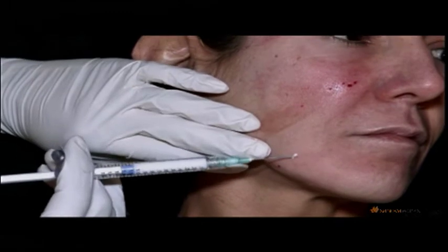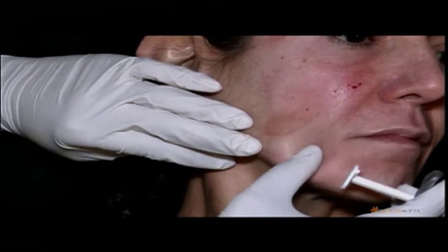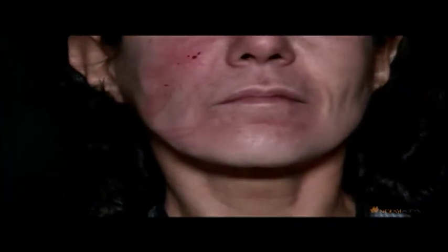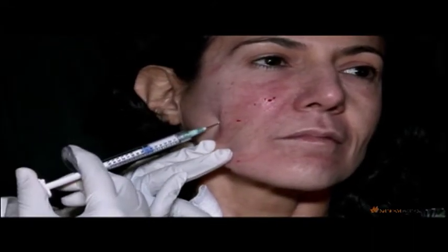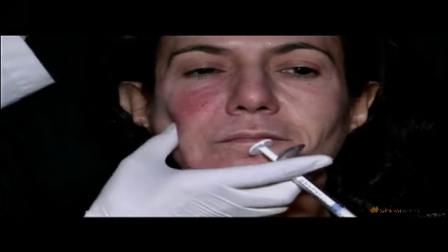All I need to do now is maybe just inject a little bit above there, subcutaneously, to get a little more lift. And we can work through the face like that. So those are really our key areas with Radiesse. And can I put some into the nasolabial folds? Absolutely. Before I do that, I'm just going to microaliquot a little bit laterally for Katya, because we mustn't forget that we can also lose volume from the lateral midface. We want to avoid over-volumizing medially and not taking care of the lateral area.